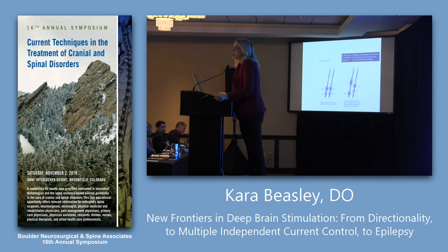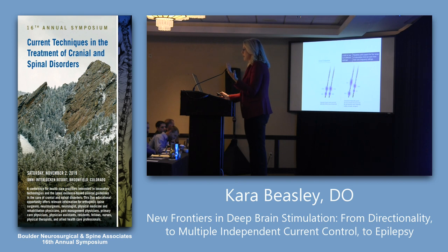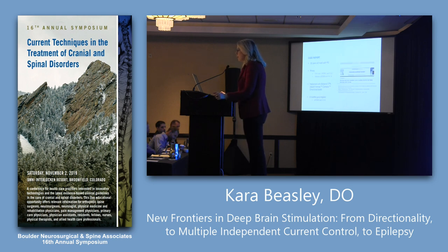So what we wonder is, what if you had somebody who has both? Instead of putting 4 leads in their brain, how about you put 2? How about you turn on stimulation in the essential tremor target to treat their essential tremor, and turn on the stimulation in the STN and treat their Parkinson's symptoms, and treat both the same way? There are folks who are setting up trials to look at that, and that's super exciting. It gives us far more flexibility than we have ever had in the brain.